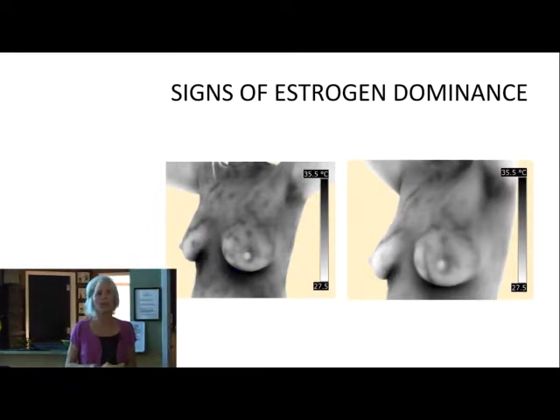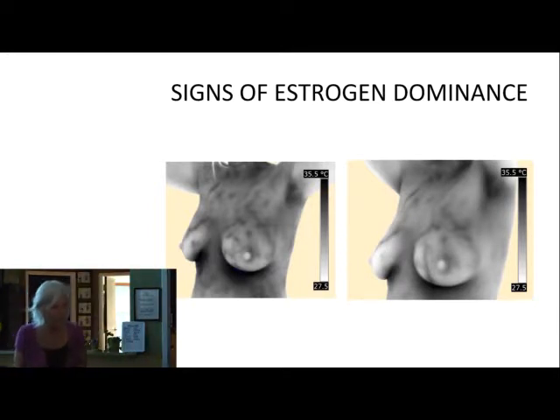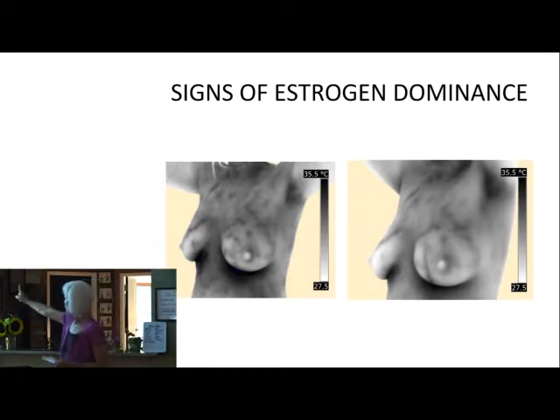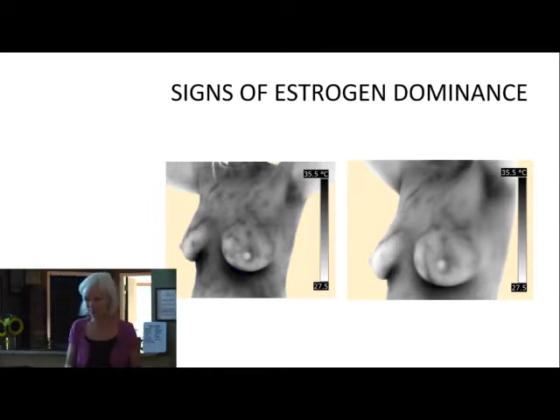Now, why does she have estrogen dominance when she is a healthcare practitioner? Well, the stress of her day that day. Stress lowers progesterone. So you might be estrogen dominant one day, but the next day when you're controlling your stress, not. When your stress levels are sky high, like it was for her that day, we're going to see that kind of image. When I re-imaged her in April, I think it was, when she did her second thermogram, I said, okay, I'm imaging you at the beginning of the day, girl. So she was the very first one I imaged. And look, she doesn't have that, does she?